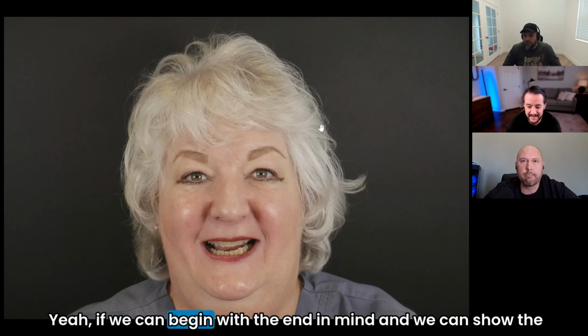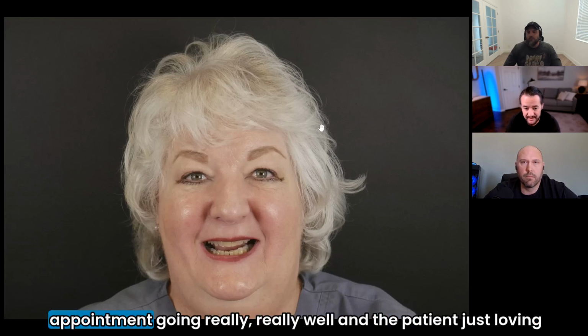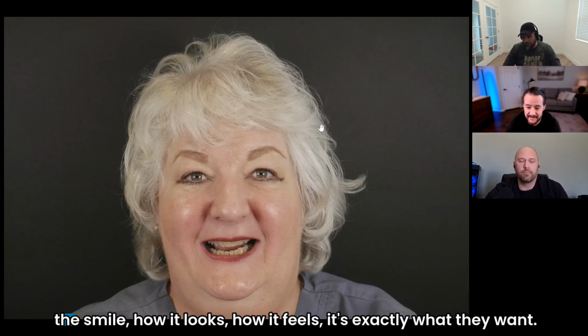Yeah, if we can begin with the end in mind and we can show the patient a likely outcome, then the odds of the seating appointment going really, really well and the patient just loving the smile, how it looks, how it feels, it's exactly what they want.